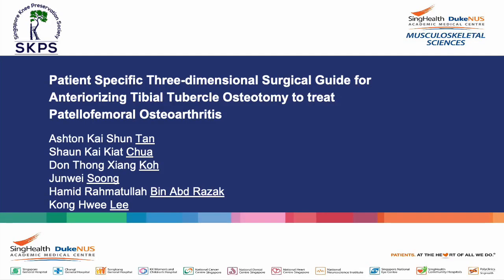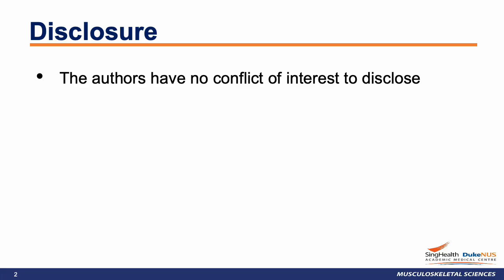In this video, the authors present a technical note on making use of a patient-specific 3-dimensional surgical guide for the anteriorizing tibial tubercle osteotomy. The authors have no conflict of interest to disclose.